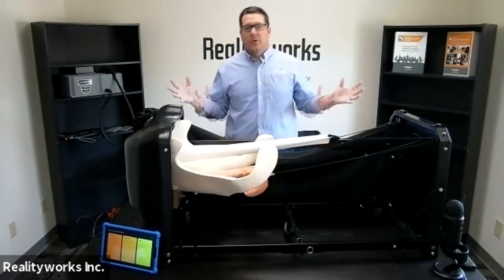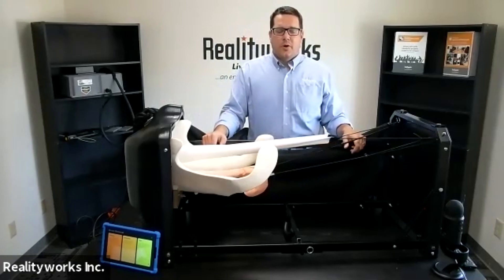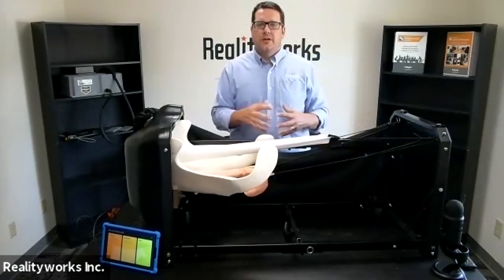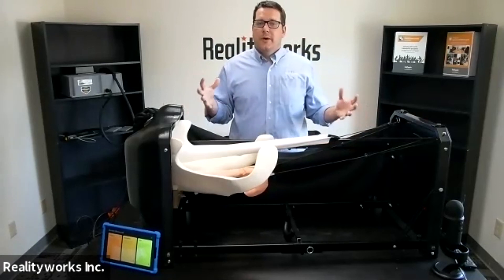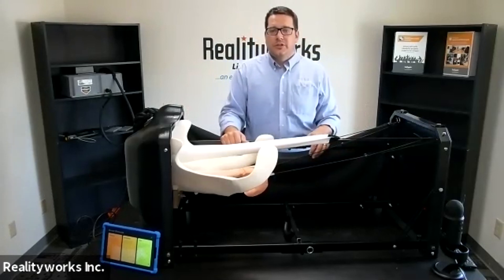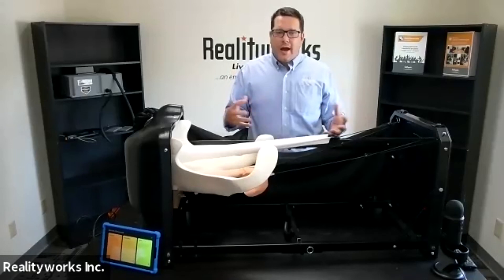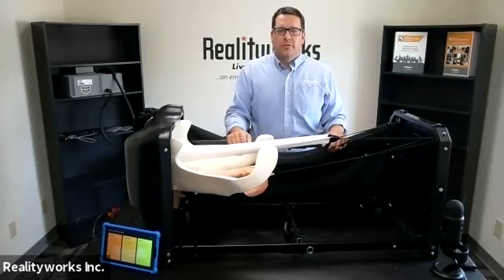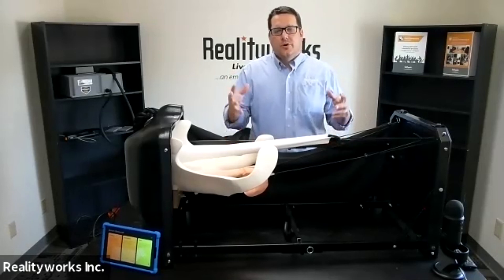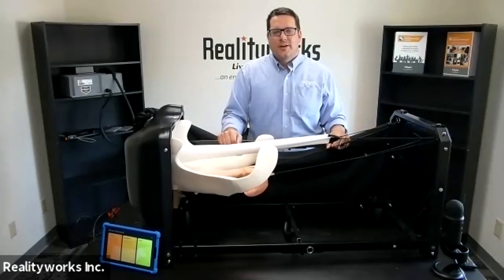All of this wraps up our bovine birthing and ultrasound product. It really is a simulation to let students understand the whole birthing process — a great tool to use in the classroom for hands-on learning. Students can get an understanding, build confidence, and practice before they do the real thing with the most realistic type of simulation that is out there. Thank you for taking the time to learn about our bovine birthing and ultrasound product.